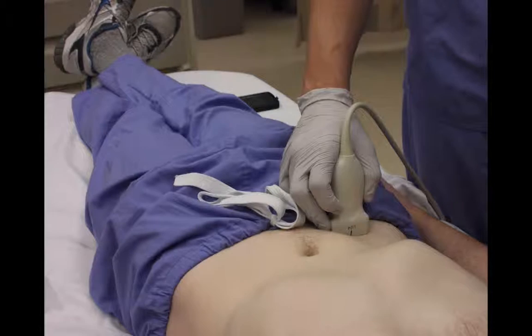As far as where to put the probe on the patient, I always start by asking the patient to show me exactly where it hurts. I say, show me with one finger exactly where your belly hurts. They put it there and I stick the transducer in that same exact area. Every time that I found appendicitis, this is how I found it.